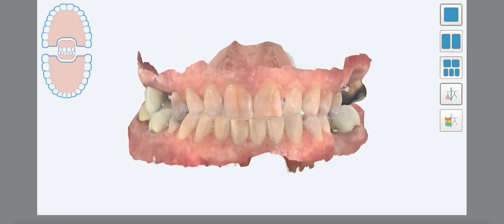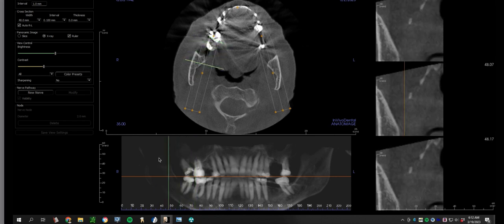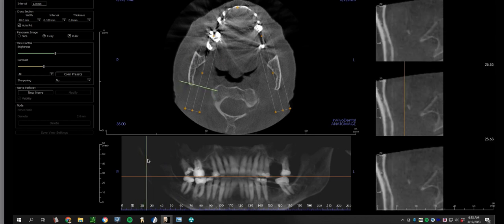So let's go over to the CAT scan. And with all CAT scans, what I like to do is treat this almost like I do with perio probing, where I start in the upper right, go to the upper left, come down, lower left, lower right. But I'm not just looking at the teeth. When we take CAT scans, we need to be somewhat qualified in our ability to understand what we're looking at. If not, we should bring in the help of an oral radiologist. But in essence, what I'm doing is I'm taking this green line here, and I'm going from the upper right to the upper left. But see how far back I'm starting here.